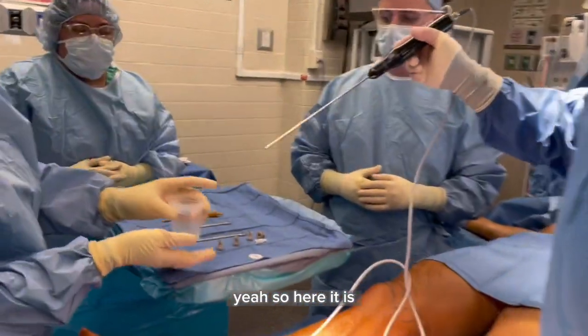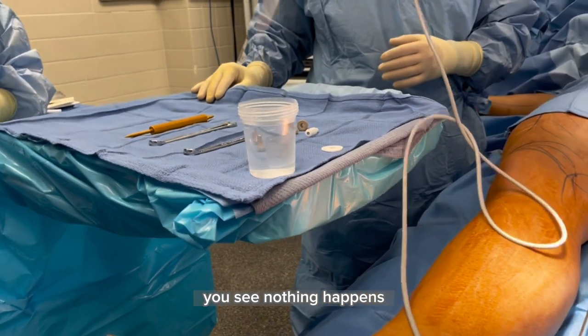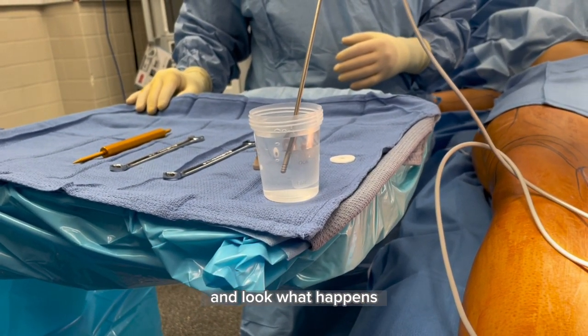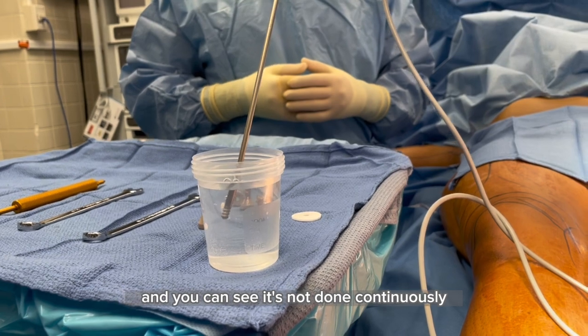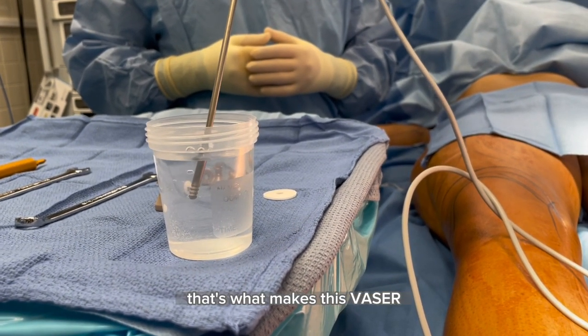So let's set it up. Here it is — I am putting this in the water. You see, nothing happens. And now I'm going to turn on the VASER and look what happens. Look what's happening on the top of the water. The machine shakes the water, and you can see it's not done continuously — it's done in spurts. That's what makes it VASER.